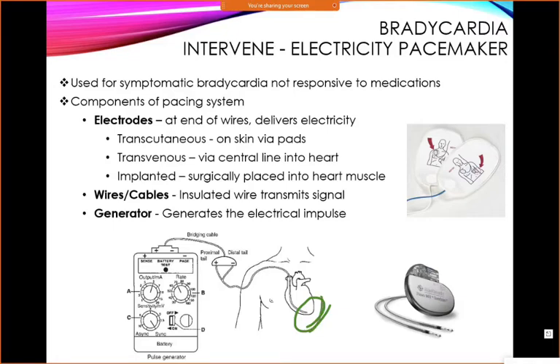On this bottom pacemaker, where is that electrode sitting? It's in the ventricle. So the only chamber that is being paced right now is the ventricle. You don't have any extra electrodes. There's nothing else going on. So this would be set as a ventricle pacer because that's the only thing that's being paced. If you set it to pace atrially, you don't have an electrode in the atrium, so it can't pace atrially.